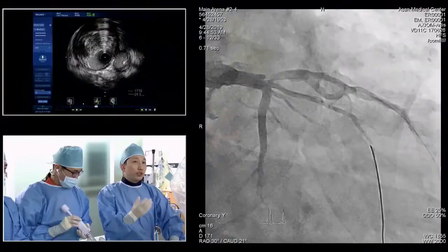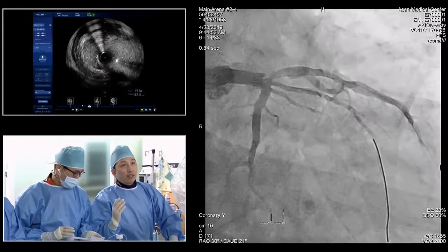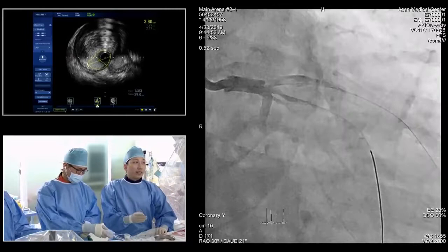Okay, so IVUS shows the diffuse disease on the left main to proximal LAD, and proximally to the diagonal branch, the vessel size was very big, 5.5, and distal to the diagonal branch, the vessel size was small, less than 3.0. So I decided to put the stent from left main to proximal LAD with 4.0 or more size.